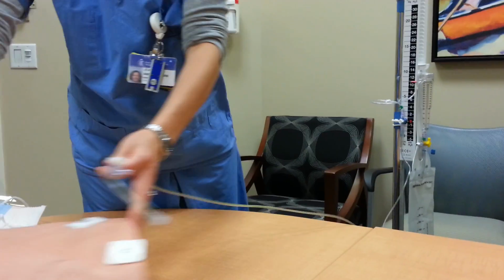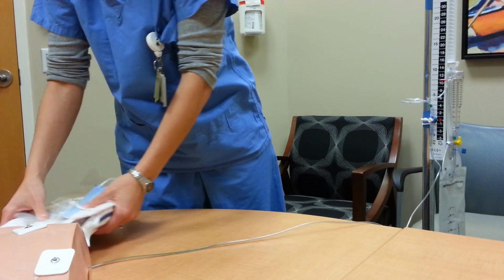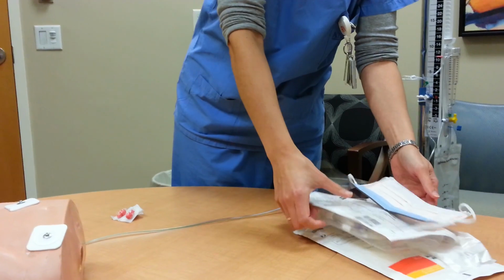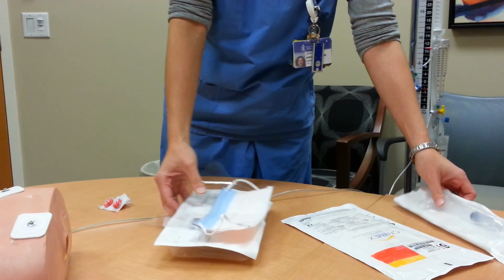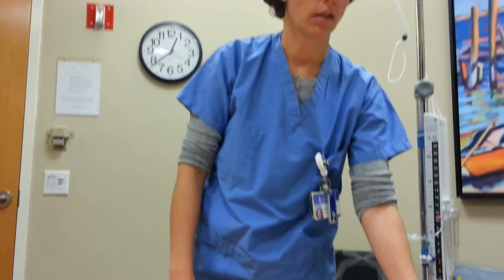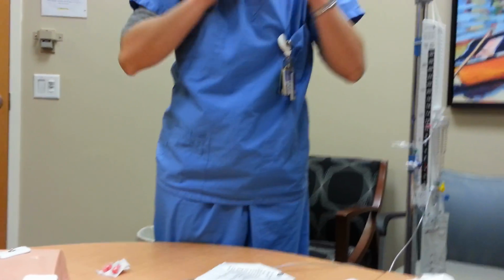The first main difference is that we set it up sterilely, whereas an A-line or a CVP or a transducer is set up clean, but this we do sterilely because the risk for infection and implications are bigger. The other main difference is we don't prime it with a bag of saline, we prime it with a sterile normal saline syringe. So I'll show you guys how to set it up.